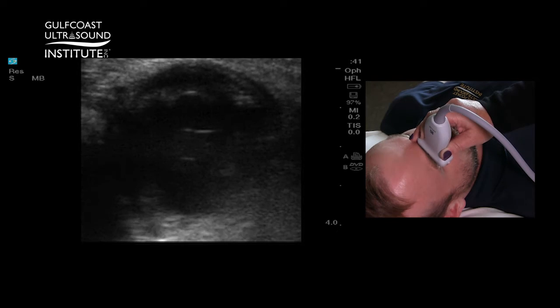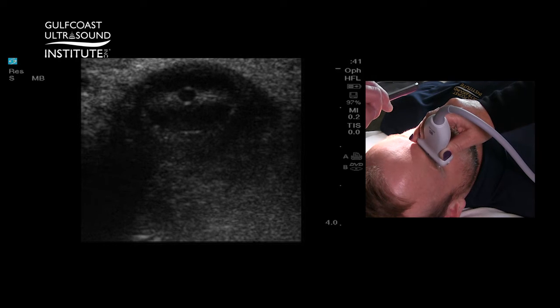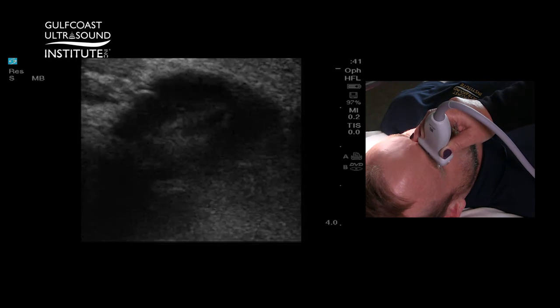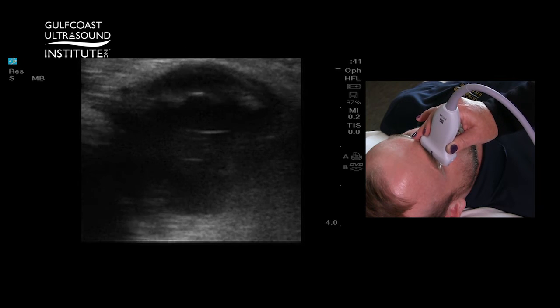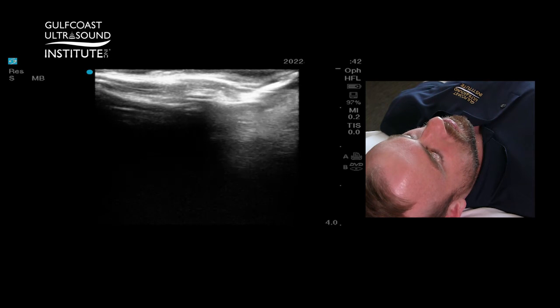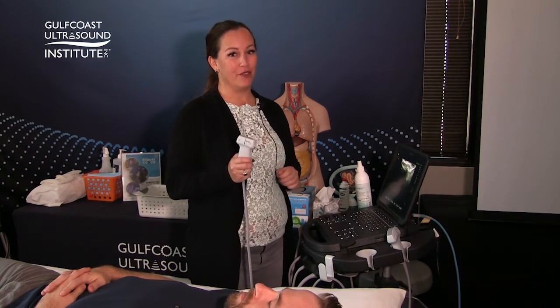Take the light away and then add it back — you can see the pupil constrict in the center of the image. This is particularly helpful in trauma situations where you have a very swollen, painful eye that you can't assess for a pupillary light reflex. And that's your hot tip of the day — now you give it a try.